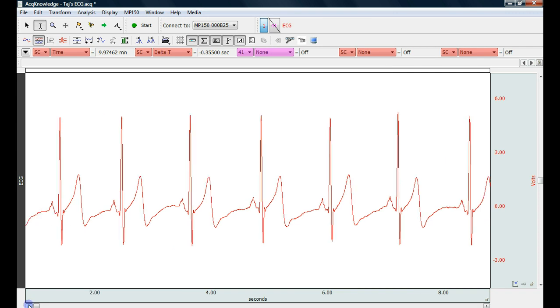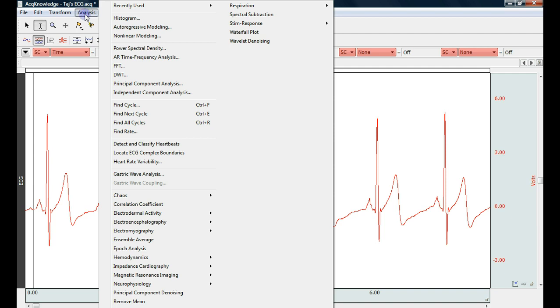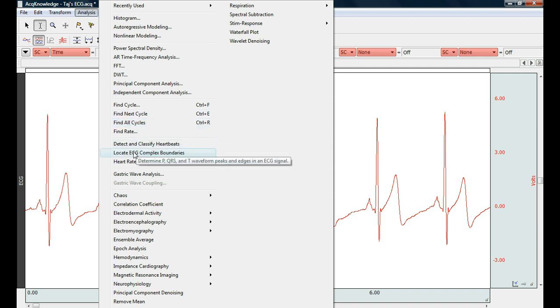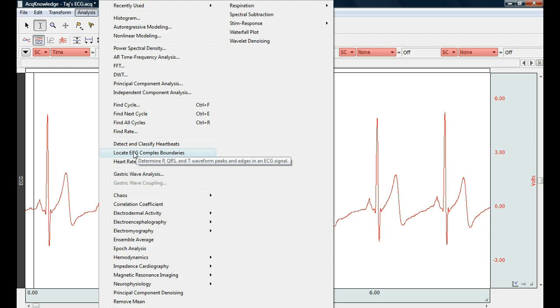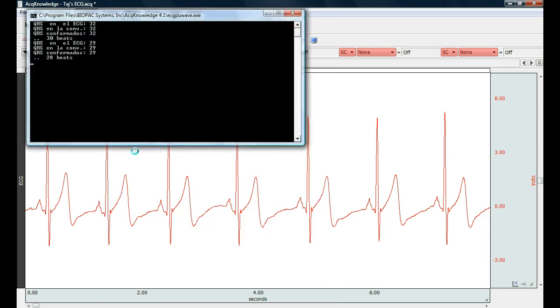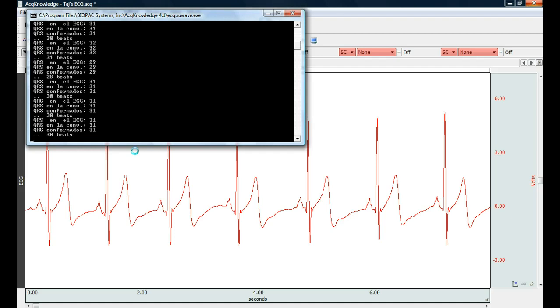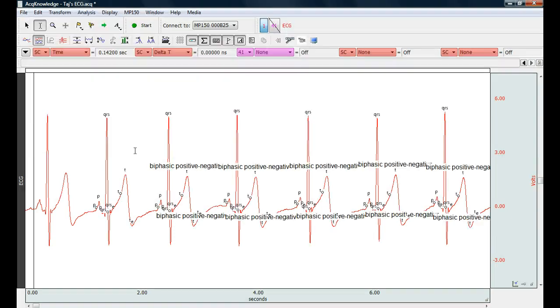Let's go to the very beginning of the file. Put my cursor at the beginning and I'm going to say locate ECG complex boundaries found in the analysis menu. This will automatically label the different ECG components as events right onto the data.